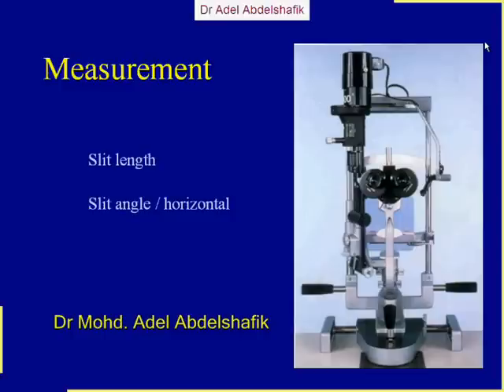So to sum up what I've said so far, we start with low magnification diffuse illumination, then we make a narrow section to make a focal section. Then while doing this, we see directly in the section, and we see to the sides. This is the indirect retro and direct retro illumination. Then we can use specular reflection to see the endothelium, or we can use sclerotic scatter.